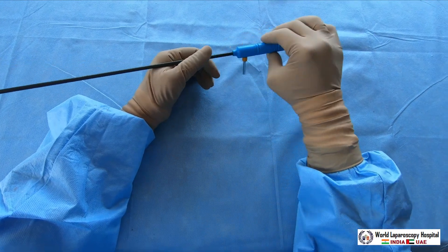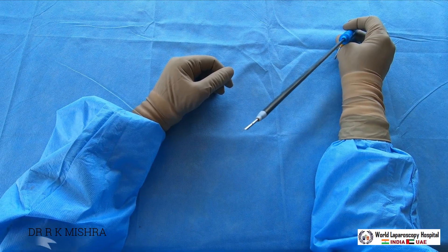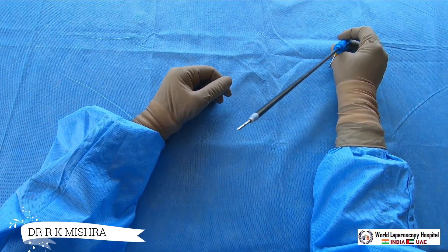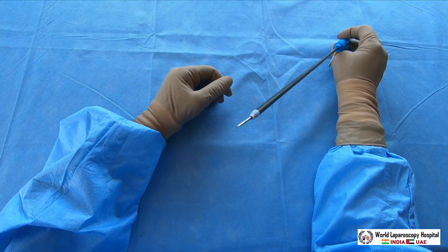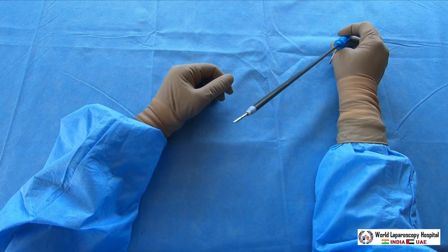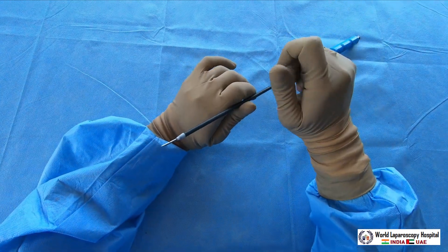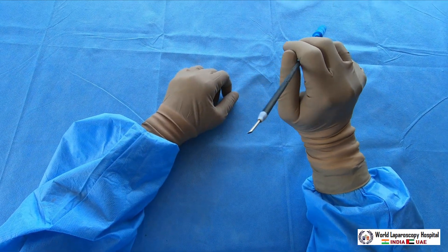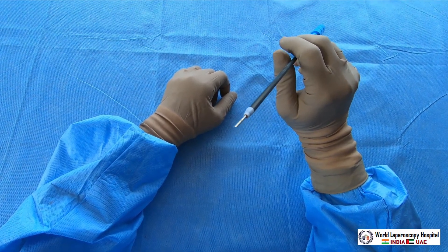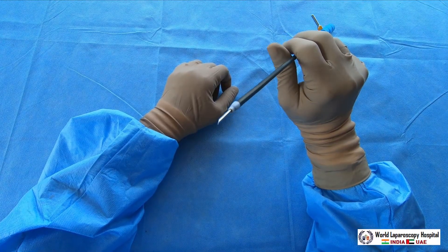It is also very good for injection of vasopressin during dermoid cyst surgery or during myomectomy. We inject a lot of fluid with 5 international units of vasopressin diluted with 20 ml saline, and you will do the hydrodissection with the aspiration needle.